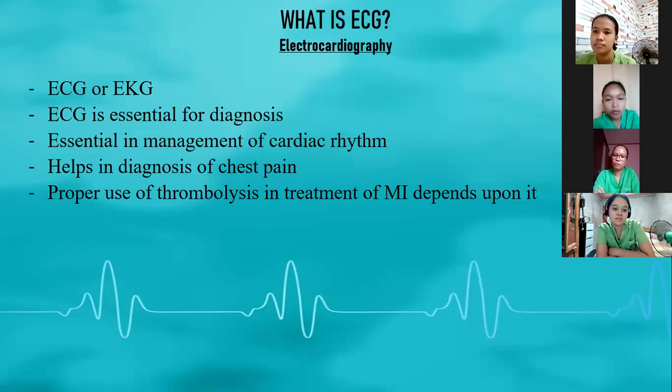So ECG or EKG, usually yan naman po ang ginagamit. Ito po ay isang diagnostic exam daw. Essential in management of cardiac rhythm, heart rhythm or sinus rhythm, ganyan yan. Then helps in diagnosis of chest pain.